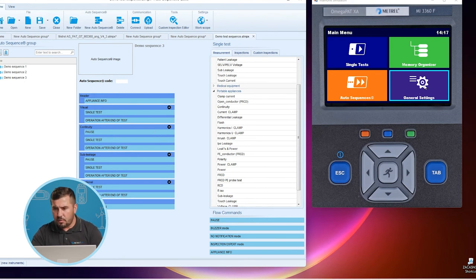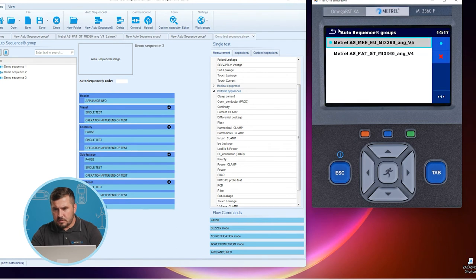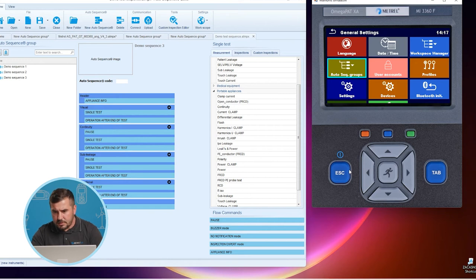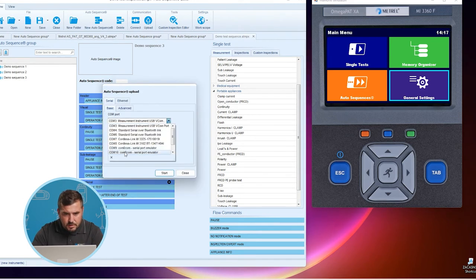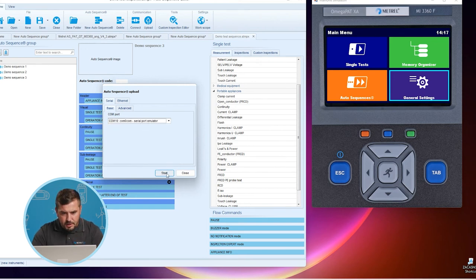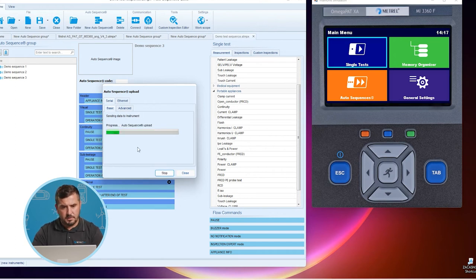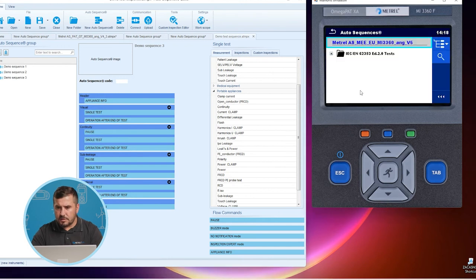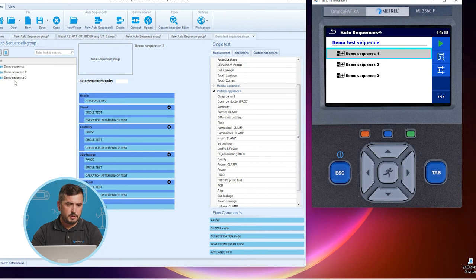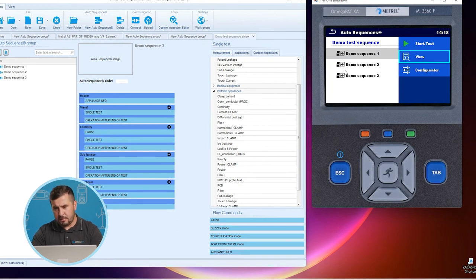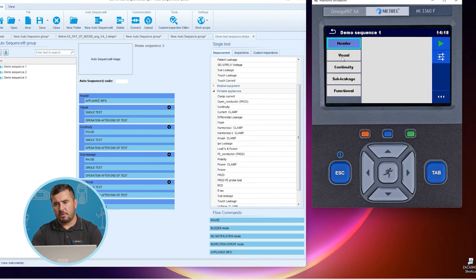Now we can search for this group on our simulator under Auto Sequence Groups. We can see here the three test sequences we have created. For each one, we can check the measurement steps on the instrument or simulator. This particular auto sequence consists of visual inspection, continuity, substitute leakage, and functional inspection. Note that flow commands cannot be seen here — they can only be observed in the PC software, but they do have an effect when the test sequence is started.